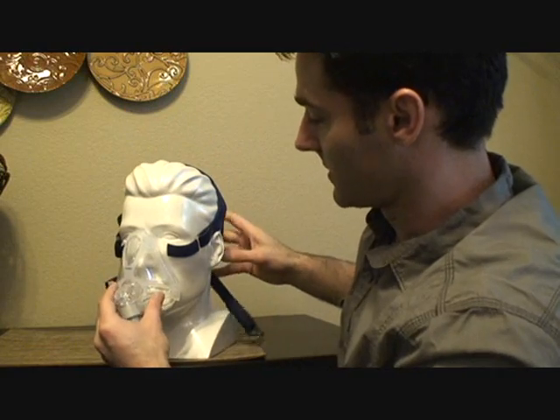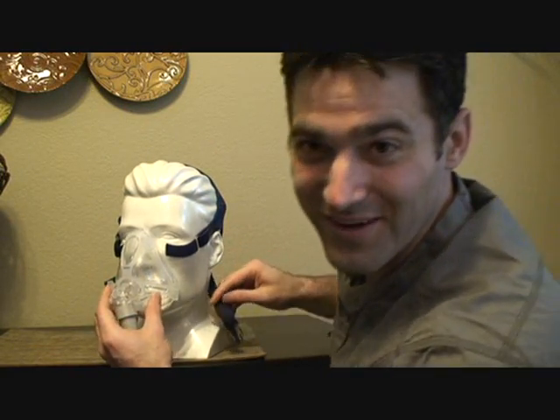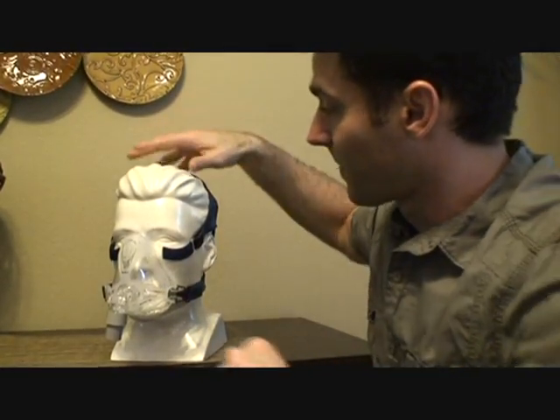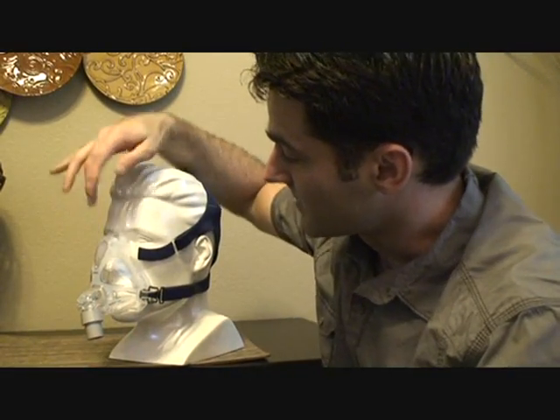Pull the headgear over the entire mask over your head like so, and then clip it in. Using a mirror for the first couple of times helps give you a feel for where it should be and where it's located.